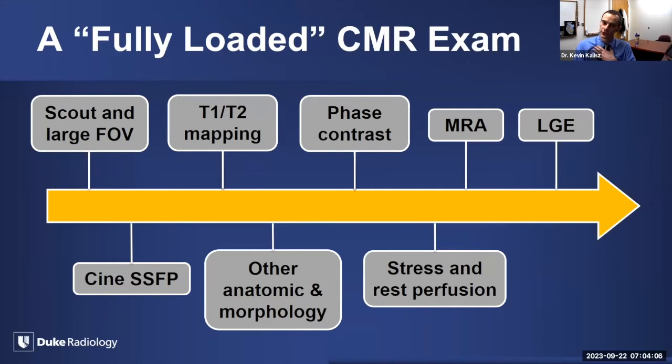This is the potential complete cardiac MR exam. We have a lot of potential options, I would argue more so than a lot of other MR subjects, whether musculoskeletal, neuro, or abdominal. You can see the potential options here and the relative flow, how they would come in the course of the exam. Some of these are optional, some of the order is even optional or debatable, but keep in mind, if you really want to do everything at your disposal for cardiac MR, we're talking upwards of 90 minutes. So we really have to choose and choose wisely.